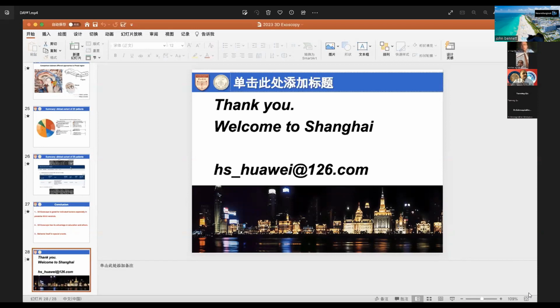So if the tumor is giant with third ventricle invasion, especially in the posterior part of the third ventricle, we would strongly recommend the endoscope or exoscope. And for the endoscope, if it's too huge, it would be difficult to get in at the first stage because of the high ICP. But for the exoscope, because it's a kind of combination of microscopy and endoscopy, it's quite easy for this kind of challenging tumors. And if the tumor invades the fourth ventricle, even if the tumor is located deep, it can still be manipulated and resected under a microscope with the poppen approach. So that's the indication here.